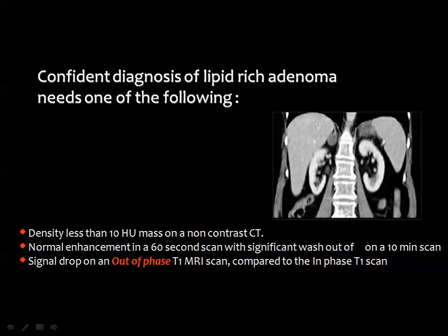Then, for the confident diagnosis of lipid-rich adenoma, you need one of the following, or some of the following. Number one, density less than 10 Hounsfield unit on non-contrast CT scan. Normal enhancement in the 1 minute scan, with significant washout on a 10-minute scan.